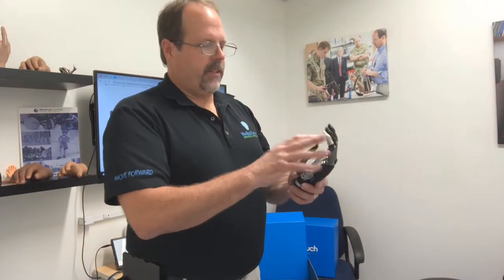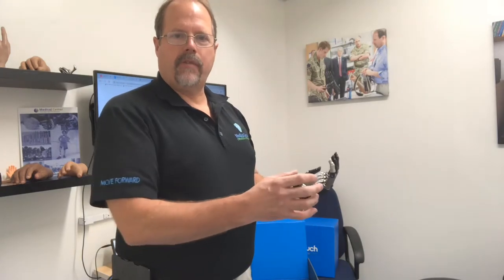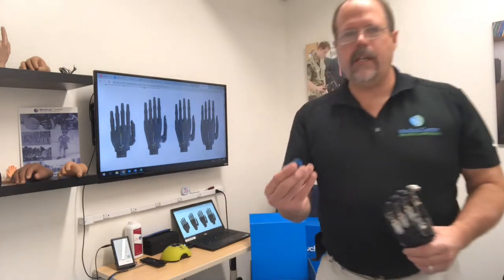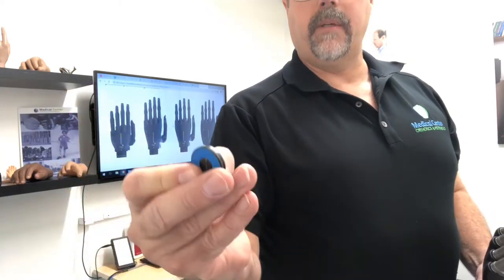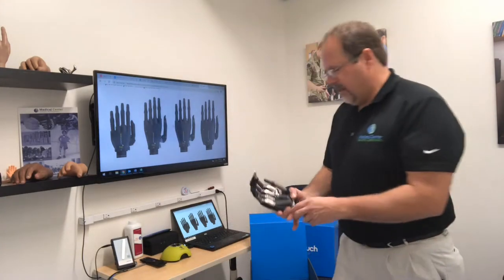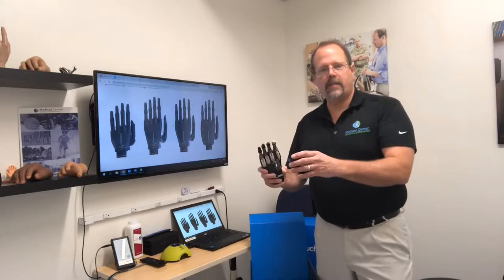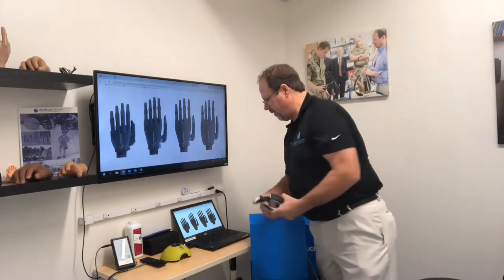They can also use the motion sensor in the device. They can do a hold open and then move the hand in any one of four directions, and it'll change into a grasp designated for that direction of movement. They can also use the Bluetooth-emitting devices as pointed out previously. One of the Bluetooth-emitting devices has a nice little sticky back film that can be pulled off and stuck in the patient's environment — for example, right near the computer. The patient can wave the hand over it and it might go into the position they want for working on the computer, maybe a finger point so they can type on the keyboard.